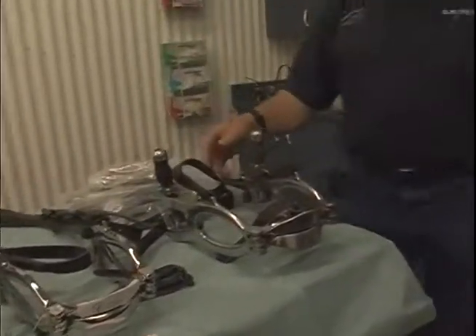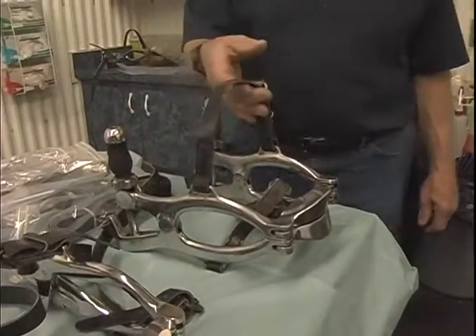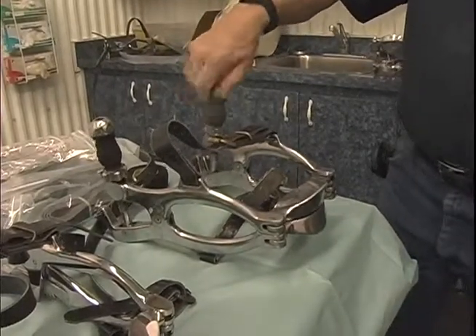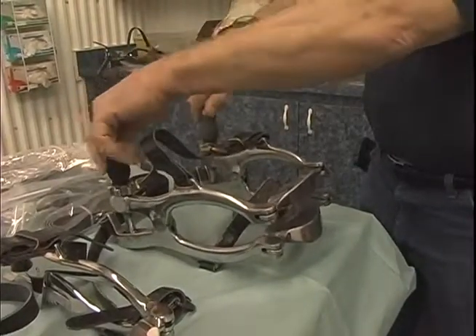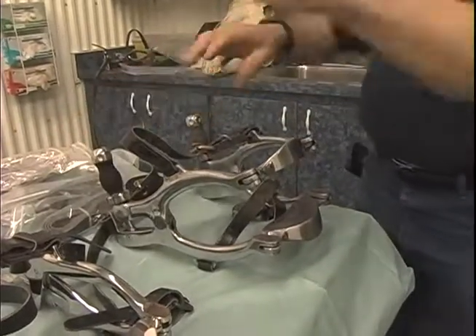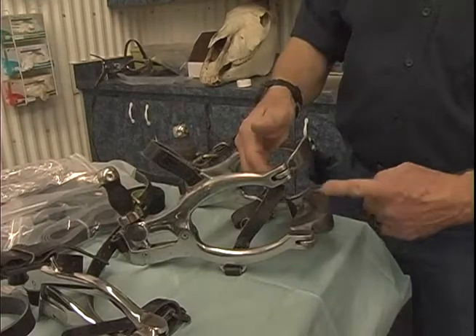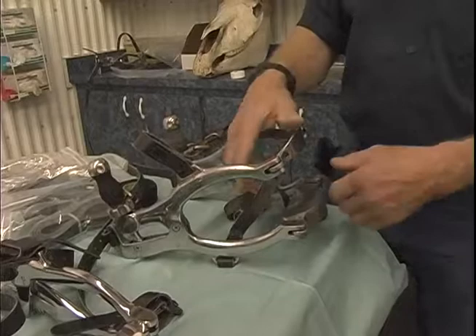So firstly, the features of the PowerFloat Speculum is it is a very safe speculum in that it cannot collapse on you. The mouth is open with these turning dials. It takes approximately 35 seconds for me to open the mouth to the full amount. Once the mouth is opened to the necessary level, which should be a distance of 9 centimeters between the incisor plates, then it's open adequately enough.